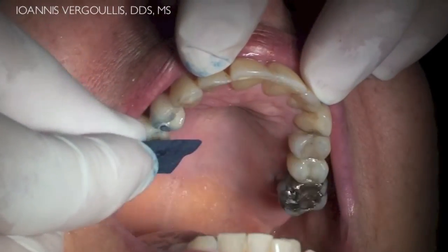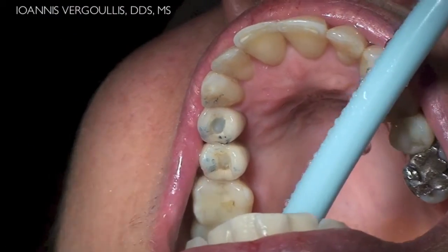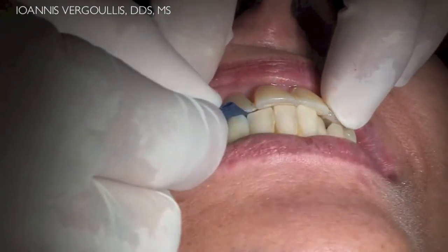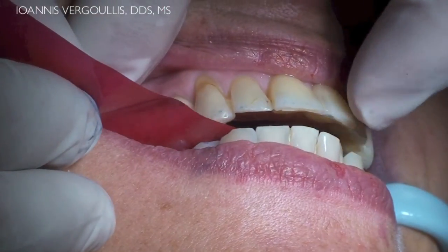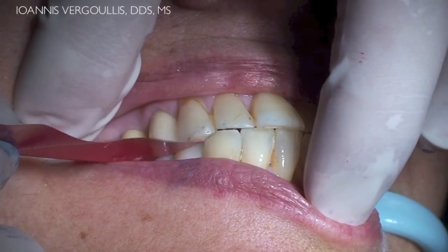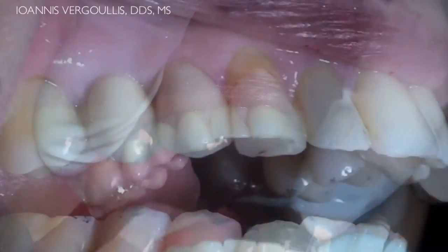We start the occlusal adjustments utilizing an 80 micron articulating paper, and we evaluate both sides, making sure we have the same type of contacts on both the right and left side. We also make sure we have the same amount of bite force all over the arch. We finalize the occlusal adjustment utilizing 8 micron articulating paper. When the patient bites down, the articulating paper can pass through under the implant crown. However, when we ask the patient to clench, the articulating paper is held apart.